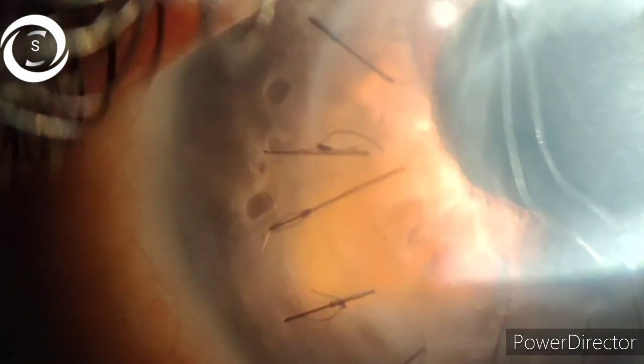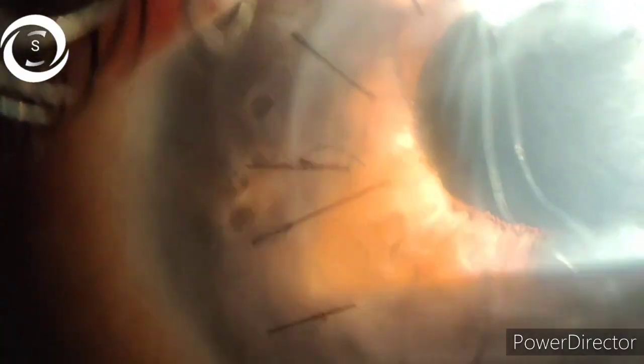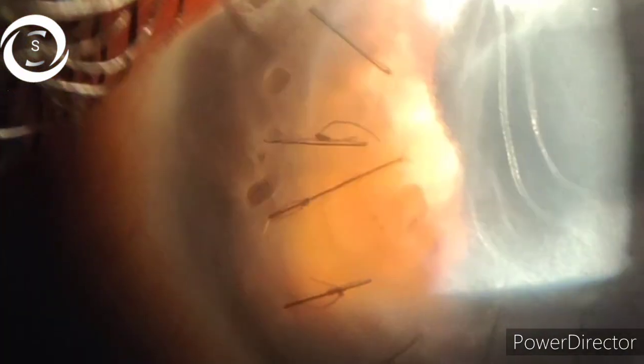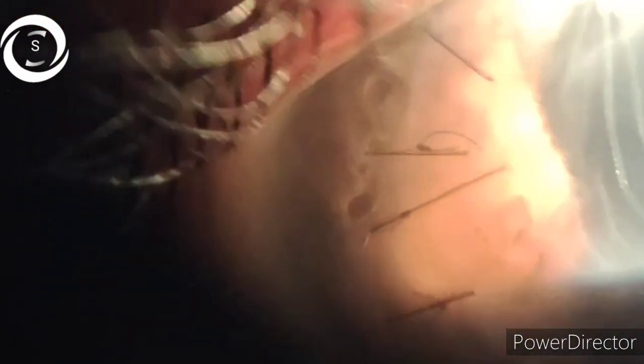Tight sutures not only distort the wound, they increase with-the-rule astigmatism and decrease vision. The longer the suture, the more steepening it causes compared to shorter sutures. Wound compression causes flattening in the periphery and central corneal steepening. In this video I wanted to show you these radial vertical lines in the cornea in keratoplasty as well as post-cataract surgery patients.